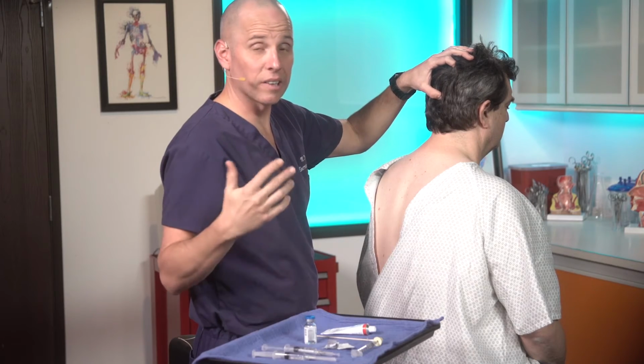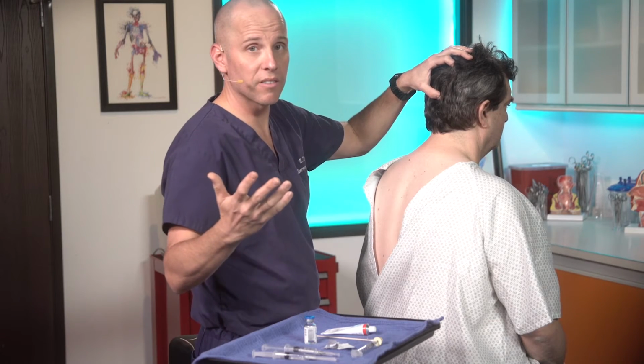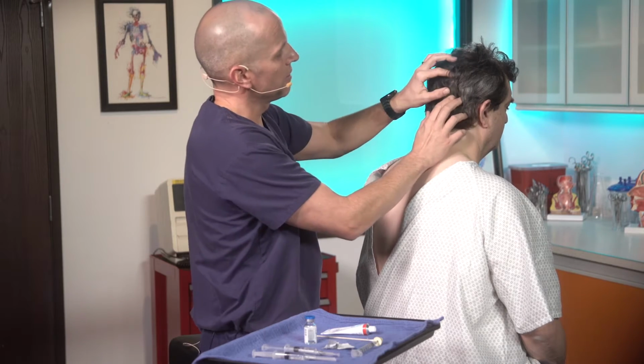I'm also not wearing gloves for this procedure. Technically, I normally would be wearing gloves, but for learning purposes, we're going to go sans glove.